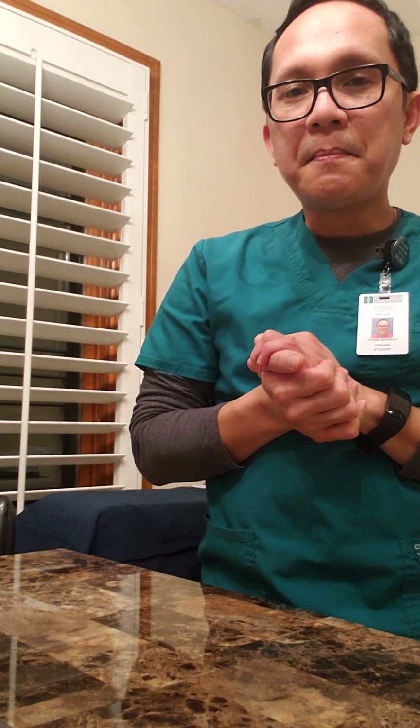So at this point in time, you're now ready to do your documentation. Now, when you're documenting, you want to make sure you put in your documentation the assessment of the catheter site before you change it and after you change it. You also want to put in the length, when you measure the length of the catheter, just to make sure it can be compared to the previously documented length to see if there's any migration.